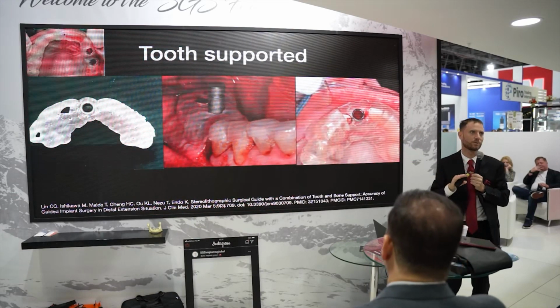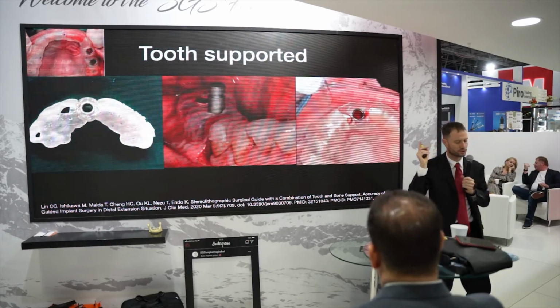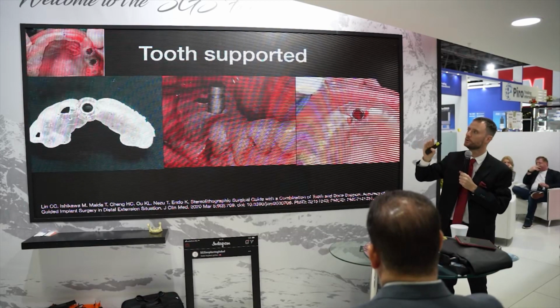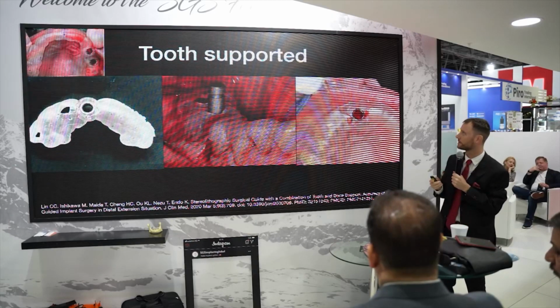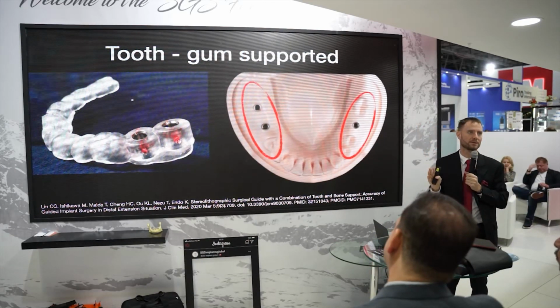Tooth supported is one of the best that you can have. It's most reliable. All the studies are showing, and I will show you also on data, it is much more precise. You have teeth right and left, both sides, where you want to have your implant site, and then you place the implant. The tooth and gum supported is a combination.